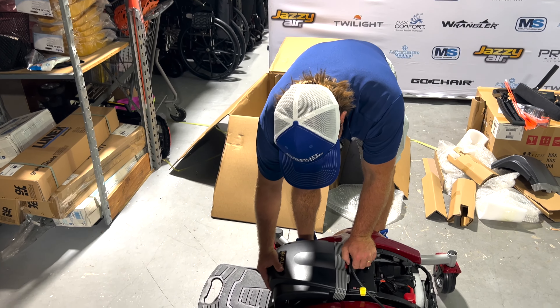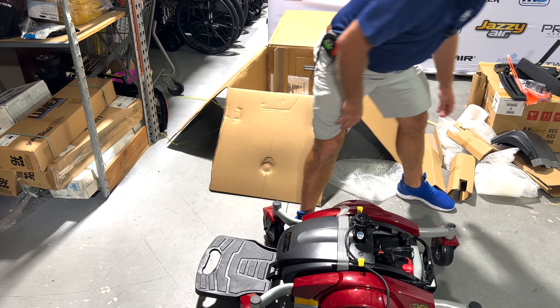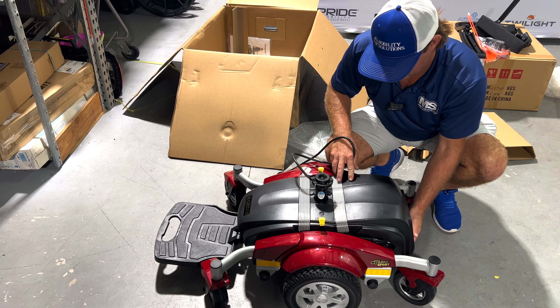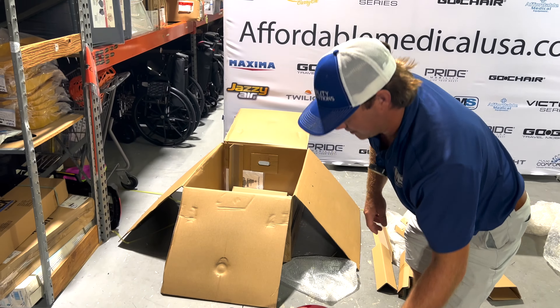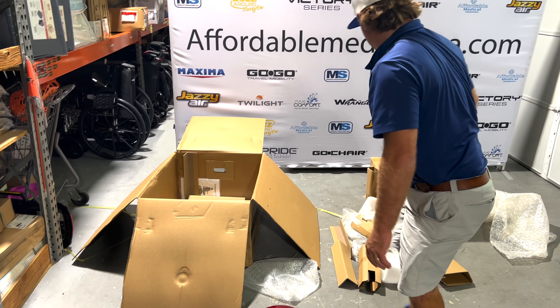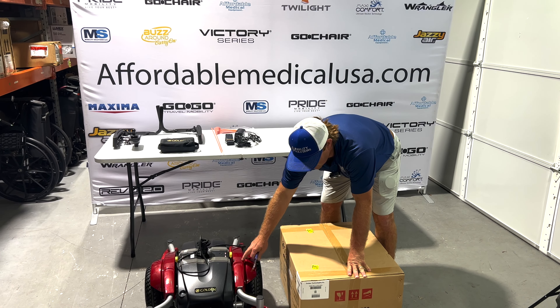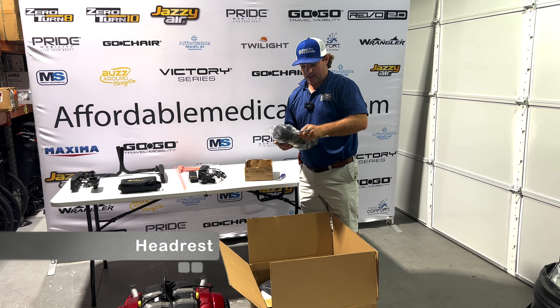We're just going to put this right back in there and push that down, come to the back, and push this right back in there. So basically, it's all put together. This seat height can be adjusted. So we've got this unboxed — this is ready to go. This can be changed to blue; they do have a blue color. There's your headrest, and all you're going to do is just take the plastic right off.